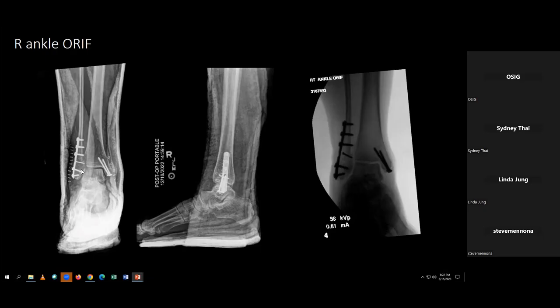To keep things simple for the medical students, what's kind of cool about looking at this X-ray is that the X-ray tells a story of how the surgery was done, with what technique. By looking at the instruments, you can tell how the fracture was reduced and also fixed. Just by looking at that screw, you can see the approach that was taken, the trajectory. There's a lot of investigative work, and it's kind of cool.